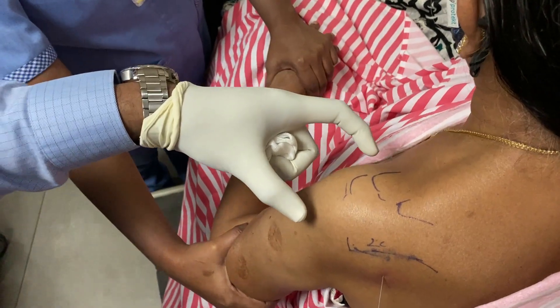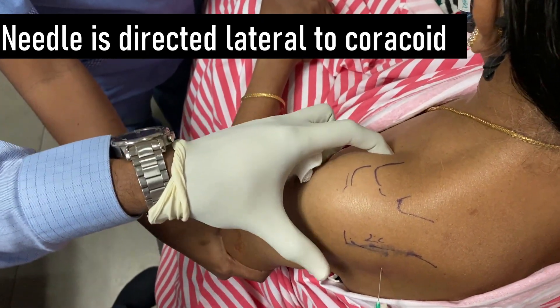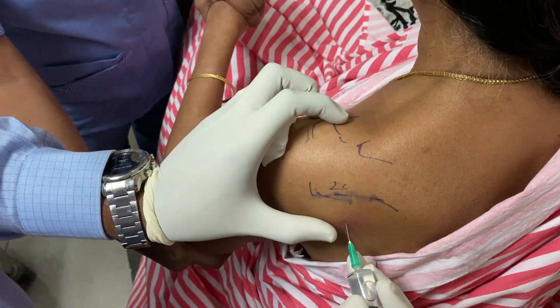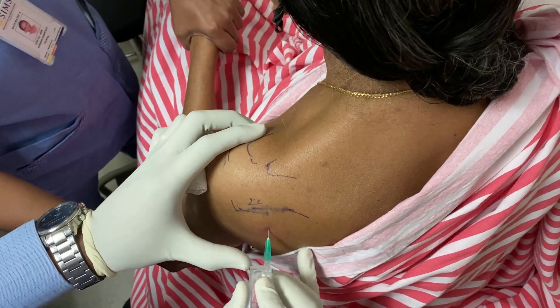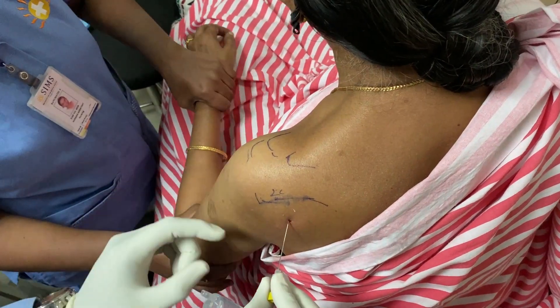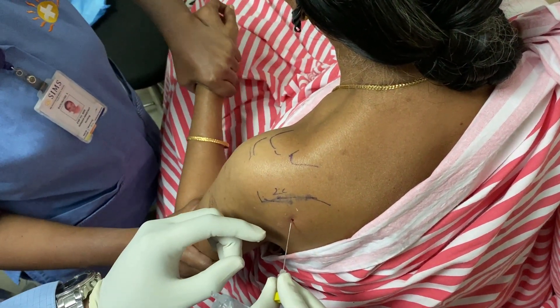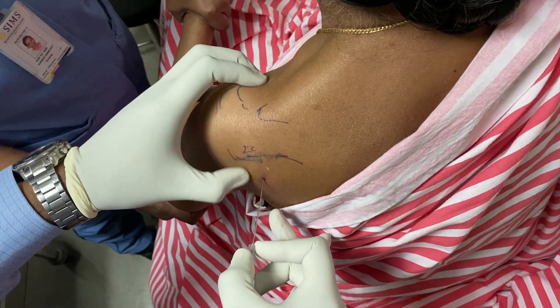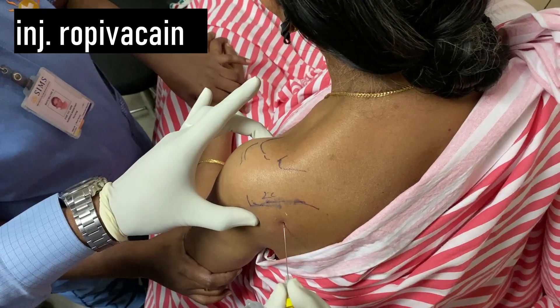The coracoid is palpated with the other hand. Once the soft tissues are infiltrated adequately, a 20-gauge spinal needle is used to enter the joint. A useful tip would be to rotate the arm. If the needle is against the humeral head, we would be able to feel the movements. And if the needle is too medial, we won't be able to feel the movement.